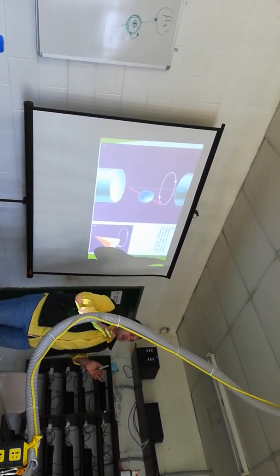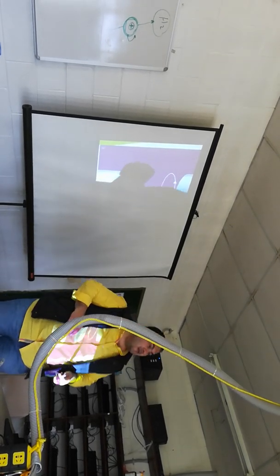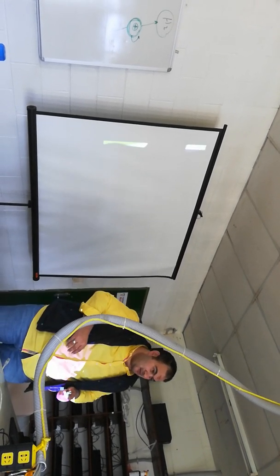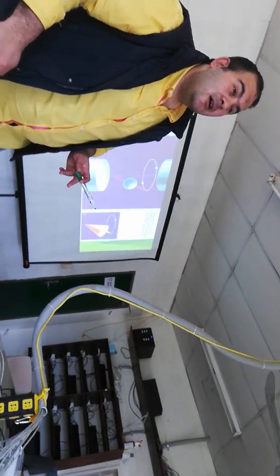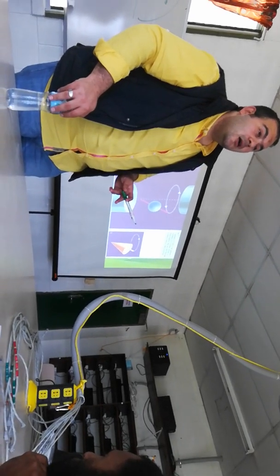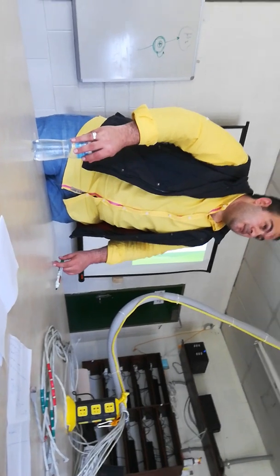Okay, so after we put the patient in the... sorry? The protons are already aligned between the north and the south. South to north. Yes. So they align from south to north. Yes. And does that depend on the source of the magnet, the source of the... sorry? The source. Does that also depend on the source?